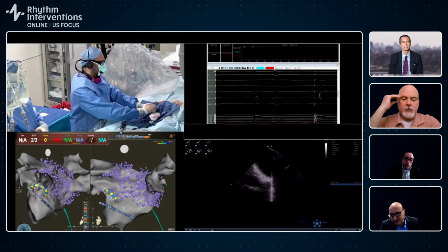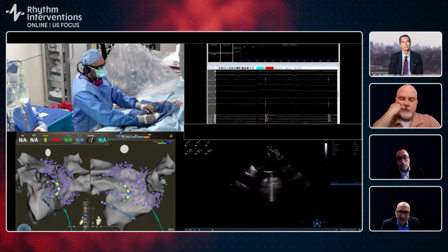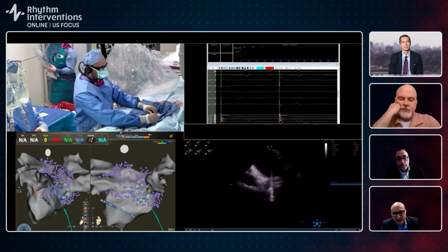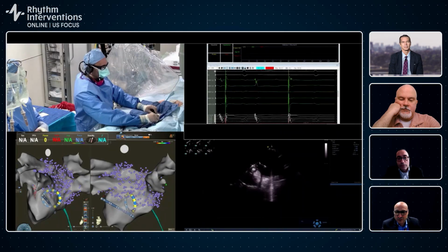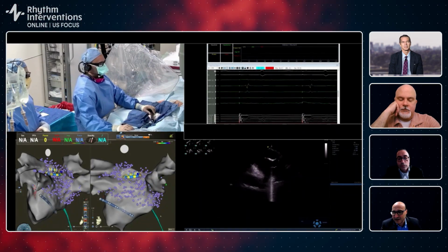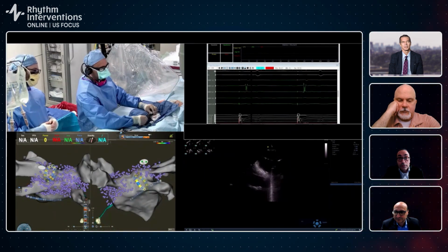Listen, it's good to be minimalistic and efficient, but frankly, that's my opinion, and hopefully it doesn't come out too strong. I really don't think you should do this procedure without some catheter for recording from in the atria somewhere, and the CS catheter gives a lot of information.